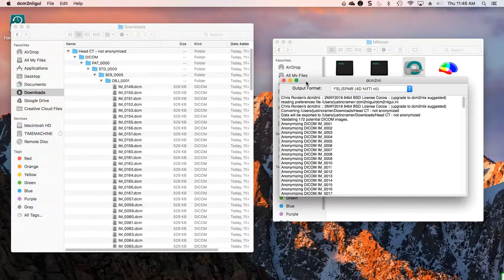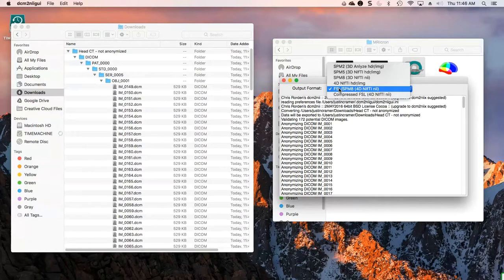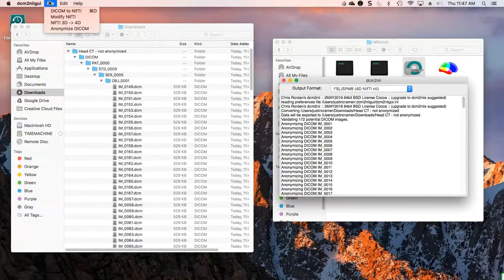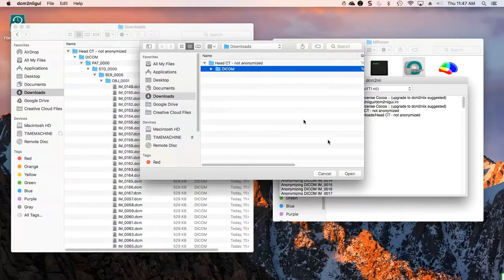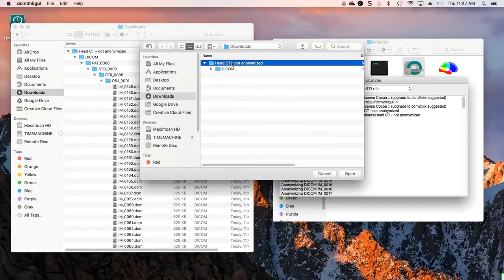The next step is to convert it to NIFTI format from DICOM. If you go over to the DICOM to NII tool and look at the output format options, you can see there are several different options. I'm going to use the FSL SPM8 4D NIFTI. The compressed FSL will create a .nii.gz gzip format that will be a little bit smaller; this will create just a .nii file. Once you select the format you want, you go to File > DICOM to NIFTI and select your folder containing the DICOM files. Based on which folder you select, that's where they're going to put the NIFTI file — my NIFTI file is going to end up in the headct not-anonymized directory above the DICOM directory.